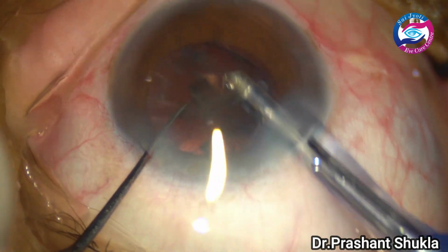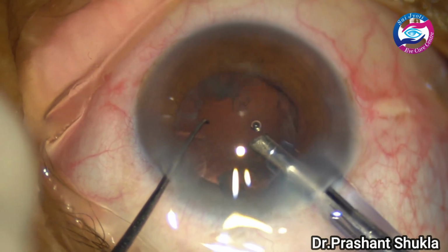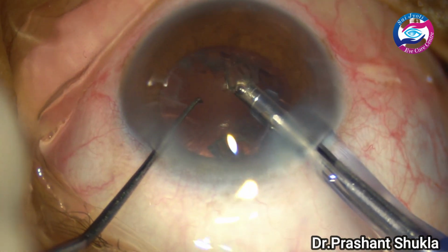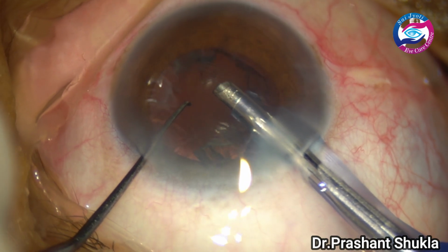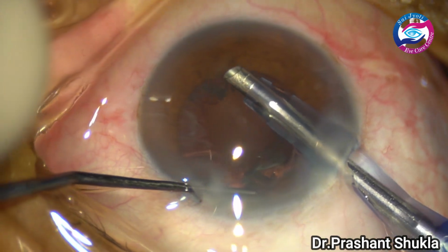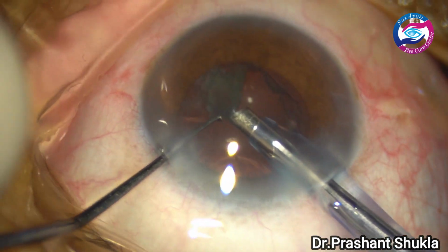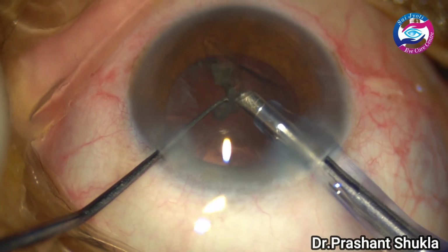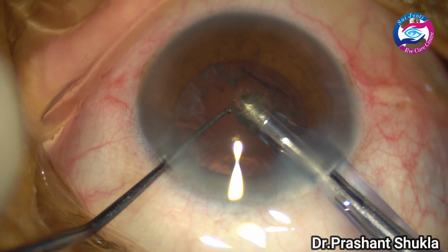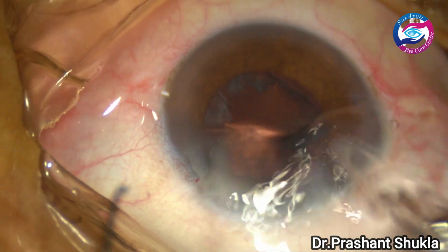These nuclear pieces are emulsified over the level of the iris, because many a times I have seen that in these moderately dilated pupils, if I do things at the level of the iris, the fluid just goes below the iris and causes ballooning of the iris. Sometimes we have an intraoperative floppy iris. So the last bit of fragments are being removed over the surface of the iris, and now we have taken care of all the nuclear fragments.